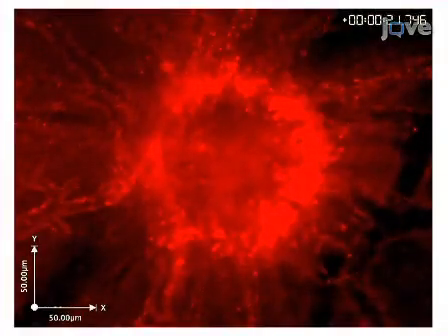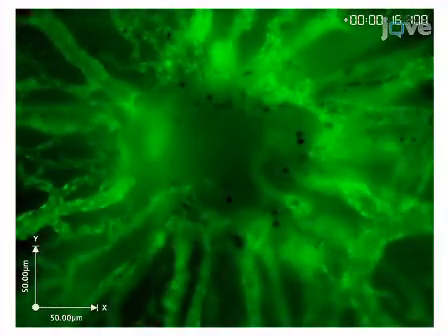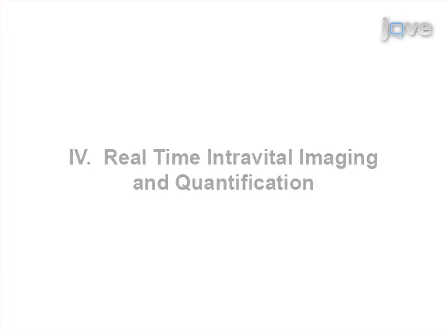Immediately after injecting the nanoparticles, image the tumors as described in the next section.